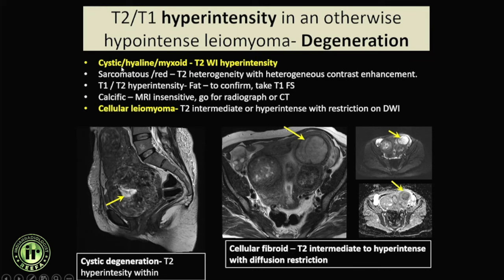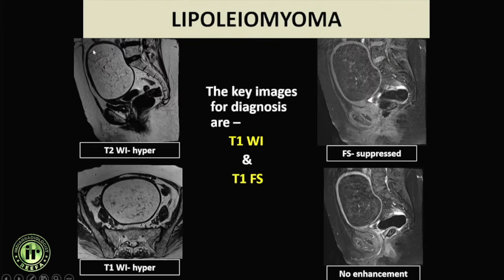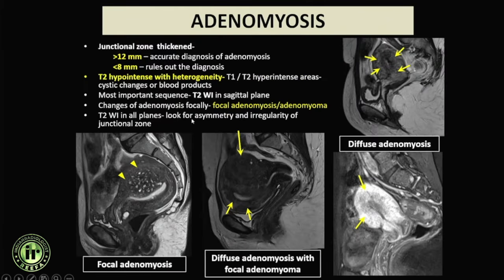The most common degenerations are cystic and hyaline, appearing heterogeneous on T2-weighted sequences with a whorled pattern and T2 hyperintense areas. More cellular fibroids are more hypointense on T2. Fibroids can contain fat, so plain T1 sequences are important before contrast; fat-suppressed sequences confirm fat content, making it a lipoleiomyoma.